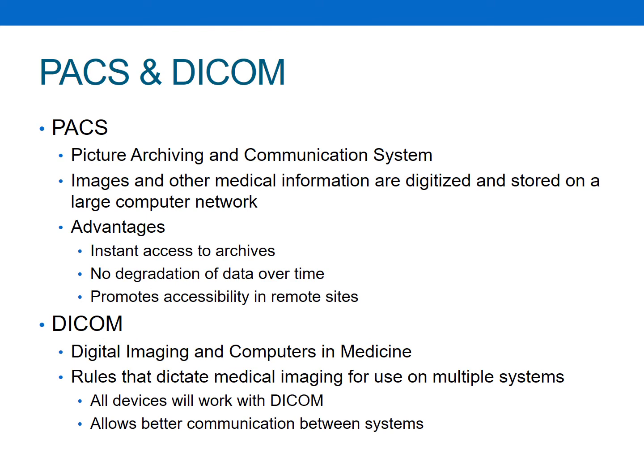So it's important for you to know what the PACS and DICOM stand for. PACS and DICOM are terms that you'll hear often in the hospital and clinic setting. The PACS system is where all of our images are typically sent to, so our radiologist can view it, and so we can view our pictures on a computer away from the actual ultrasound system. DICOM then is the information that is embedded into the picture and is a specific formatting of the picture. So make sure you know the difference between the two and how they apply into our clinical setting.